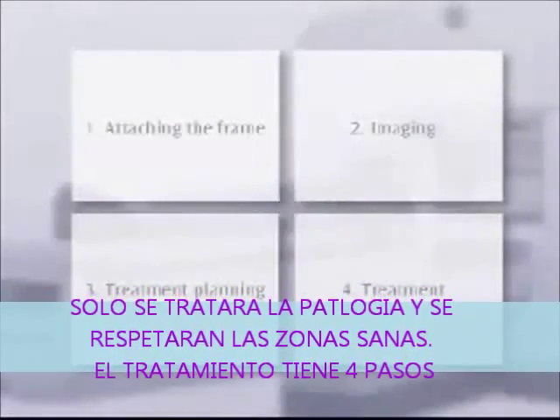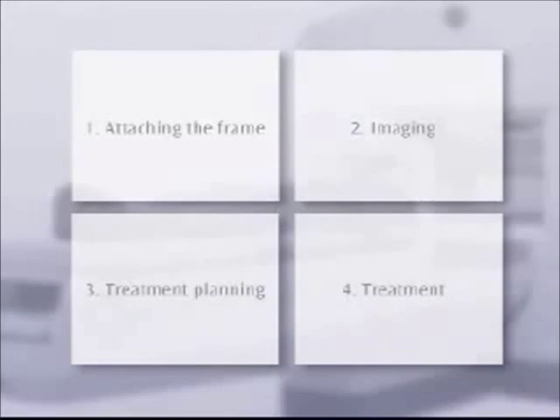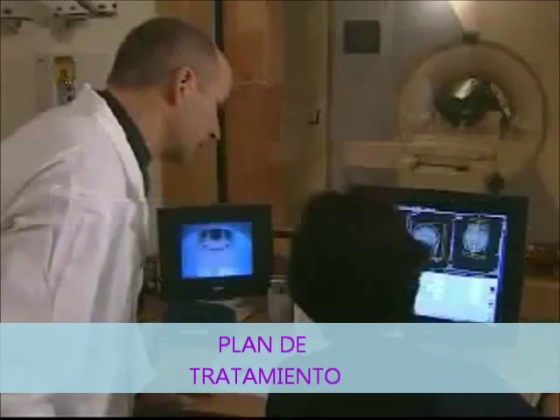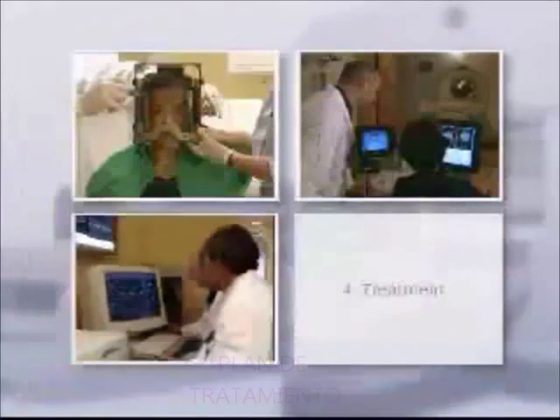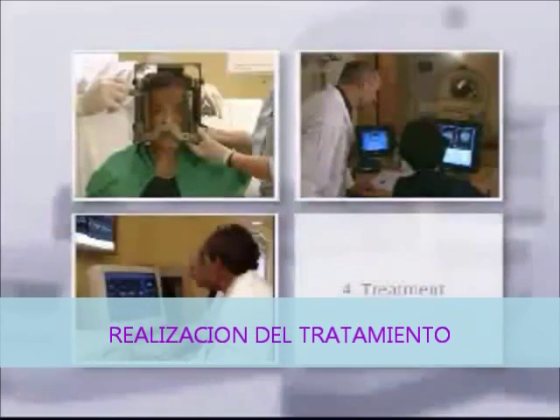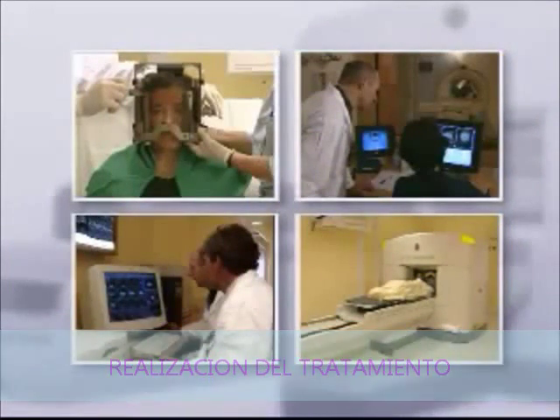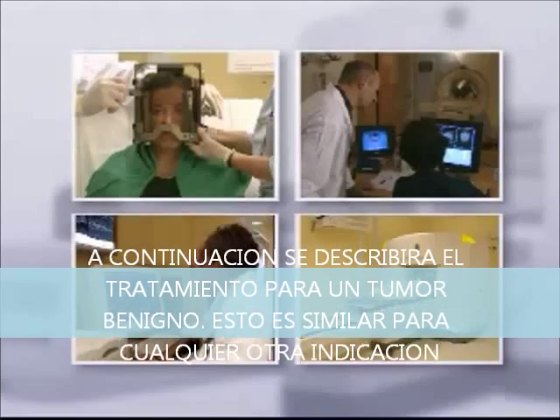In most cases, you'll be given a single treatment. This involves four main steps: attaching the frame, imaging, treatment planning, and the treatment. A specialized team will take care of you throughout the entire procedure, and usually you're awake at all times. The following describes the procedure for treatment of a benign brain tumor; however, the treatment is similar for all indications.